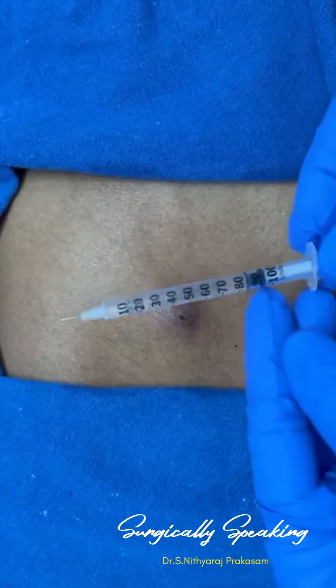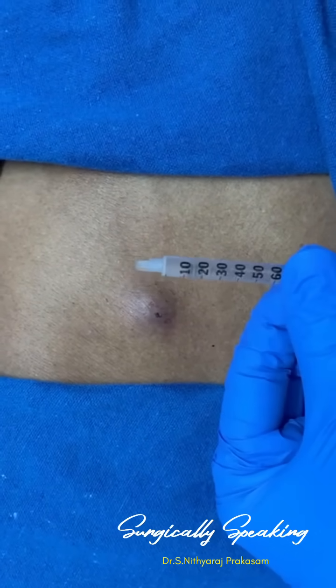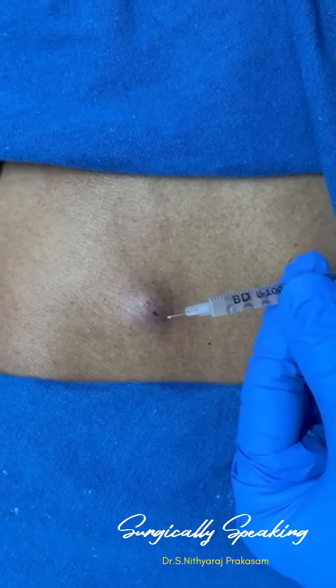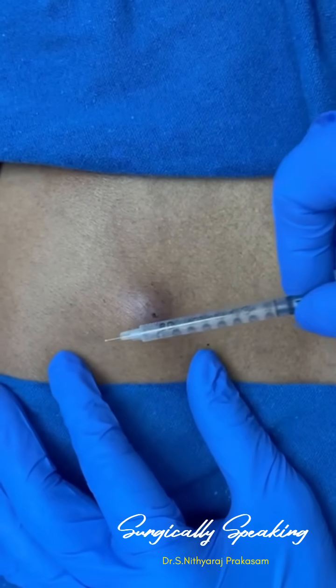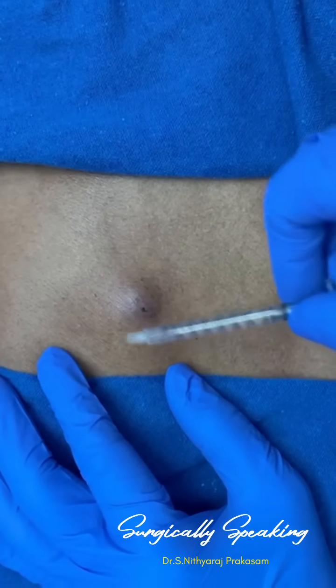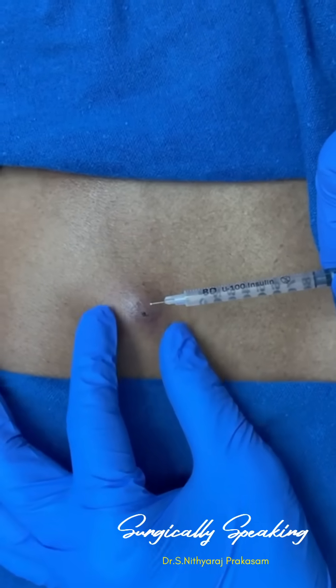And look at this. I always use this. You focus on this. This is an insulin syringe. I like this because the needle is very small, and the patient tolerates this injection very nicely. Normally people will infiltrate all around. So much local anesthetic will be infiltrated all around. That is too much, and that much need not be injected.